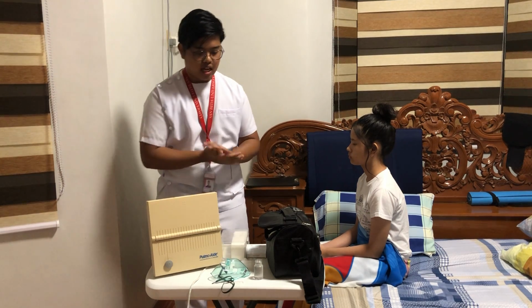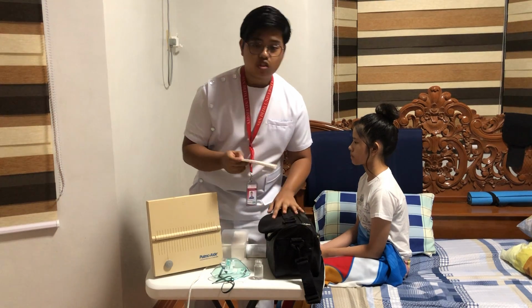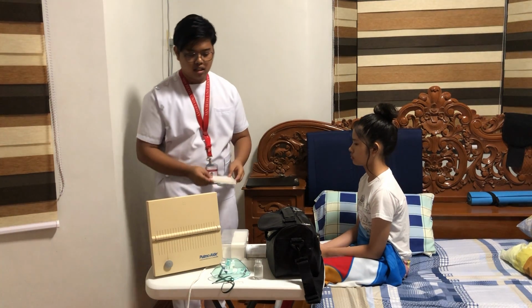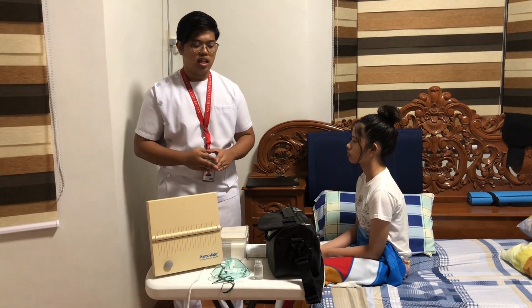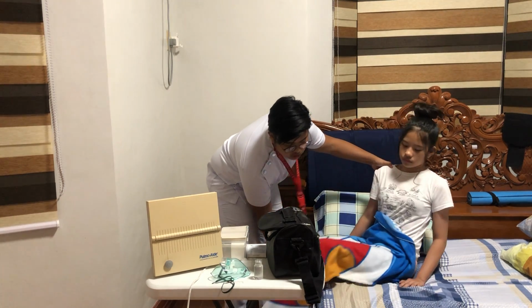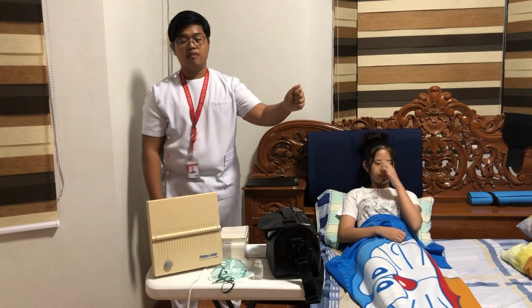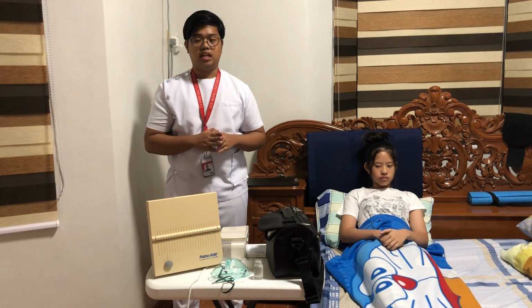After doing such things, the last thing that we need to do as nurses is to document any findings and data that we have gathered. And then after we document it, we also need to document the procedure that we have done. And then again, we provide aftercare, bring back the patient to a position that is comfortable for her. And then again, provide privacy by closing the door, reinstalling the curtains, and etc.